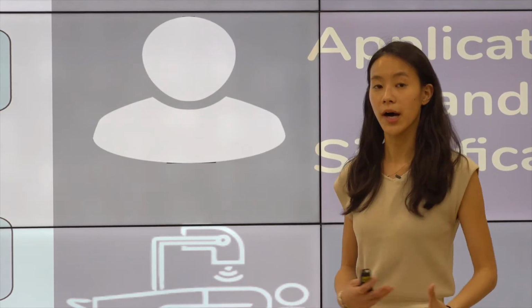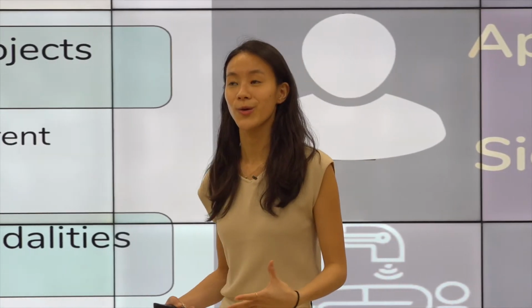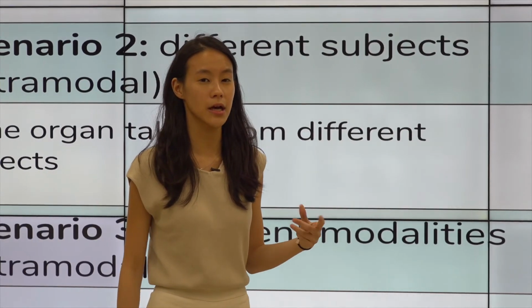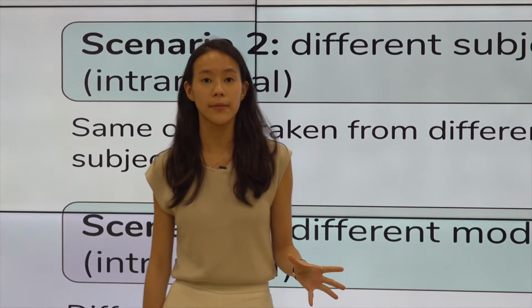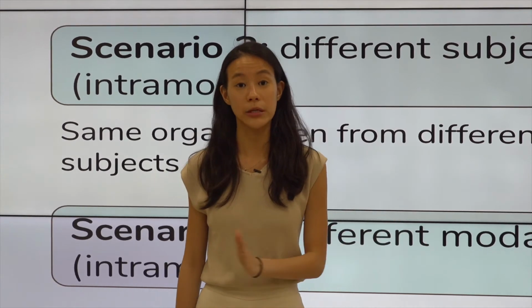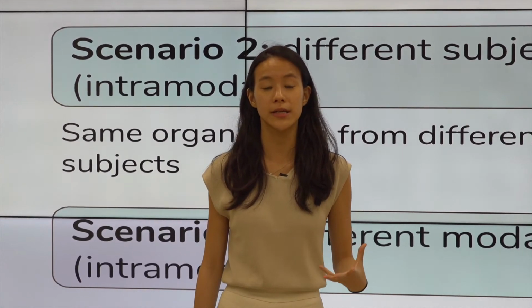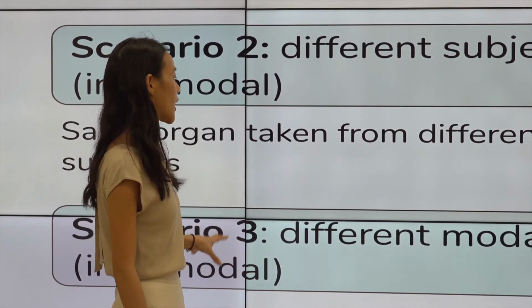And so in this case, by having a registration process, we're able to register these 2 different images together as the patient is getting transferred from hospital A to hospital B, so that the doctors are able to compare or analyze this patient's condition or situation. Maybe the scan was taken 3 months before, or maybe it was taken 6 months before. And seeing that disease progression is very important for the physician in order to identify tumor types and the progression of treatments or the effectiveness of treatments. So this is where registration may become important when we're talking about different modalities.